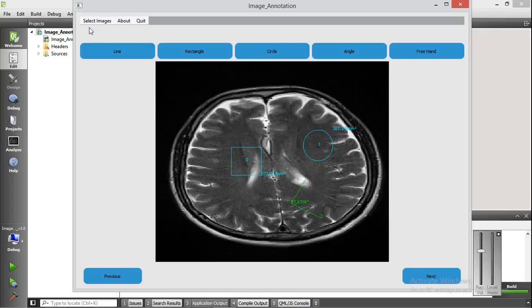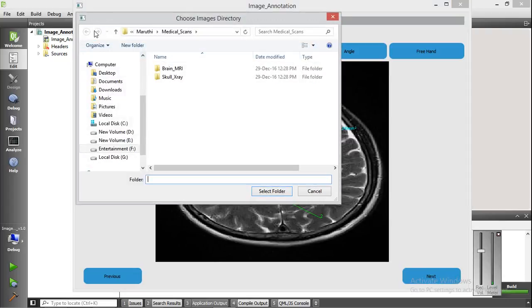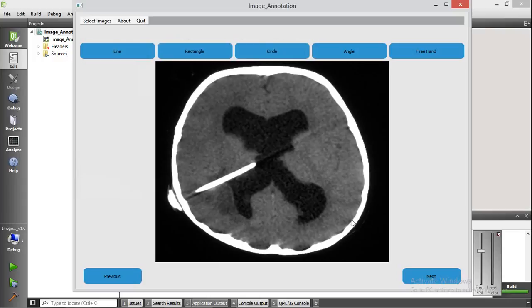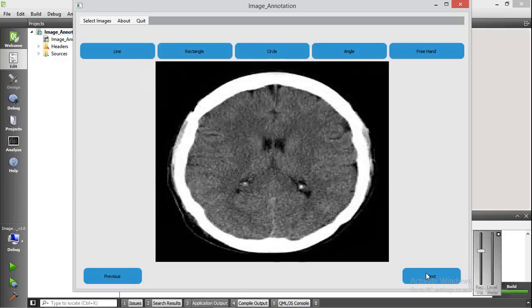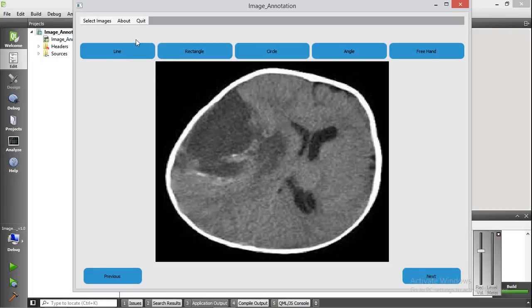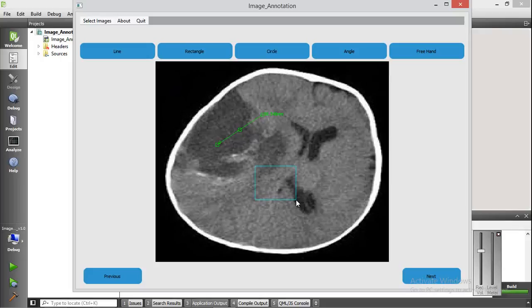You can also change the images that are selected. Now I am selecting a skull x-ray. A different set of images is loaded to the image annotation tool, as you can see here. You can annotate these images as before — here I am annotating with a rectangle, which you can move.